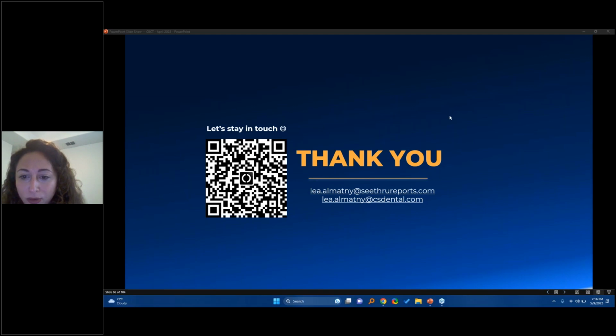What's a good beginner course for CBCT interpretation? If you already have a Carestream machine, then keep in touch to know when we have hands-on courses.